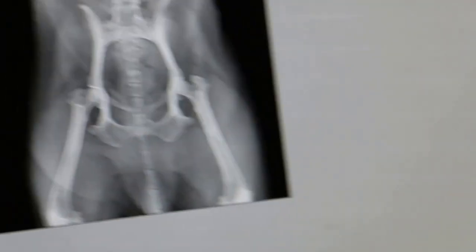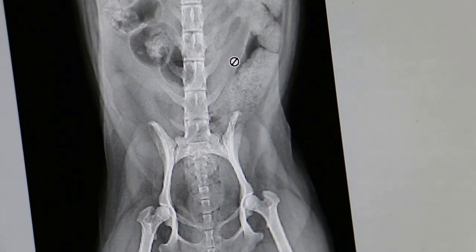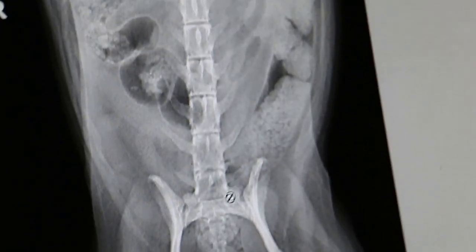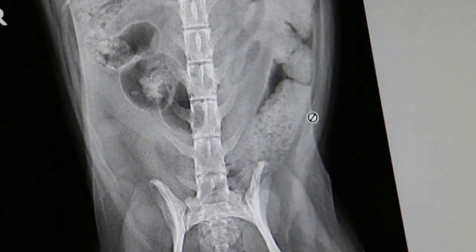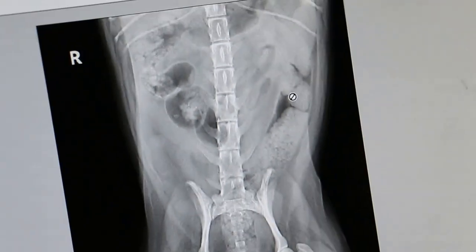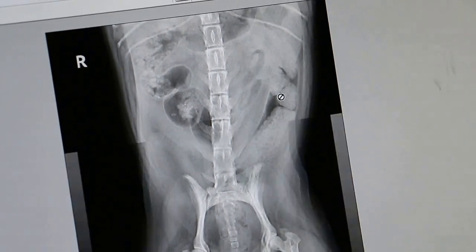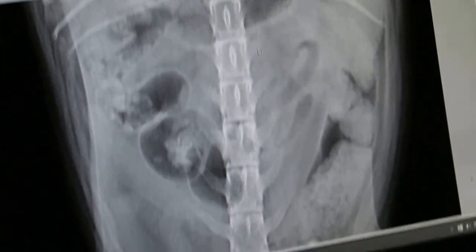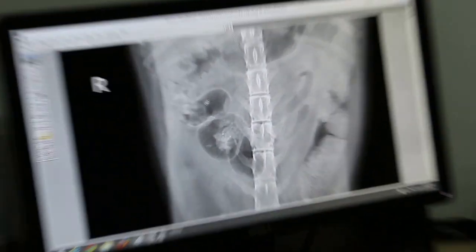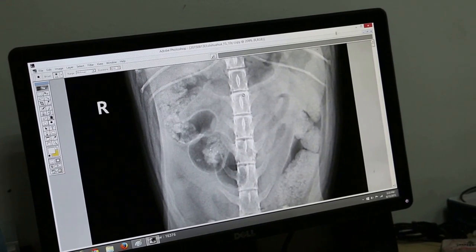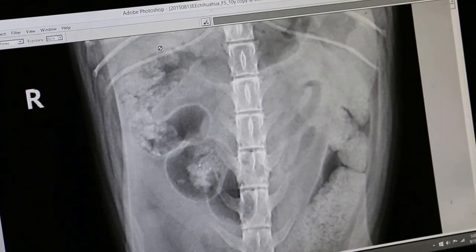Now we look at the last X-ray. The only thing I can say is this dog has a very good appetite — you can see the bowels are really full of stools. There is also some gas inside. It would have been easier to see if the dog had gone to the toilet before the X-ray. Overall, she has an excellent appetite — she really likes to eat.